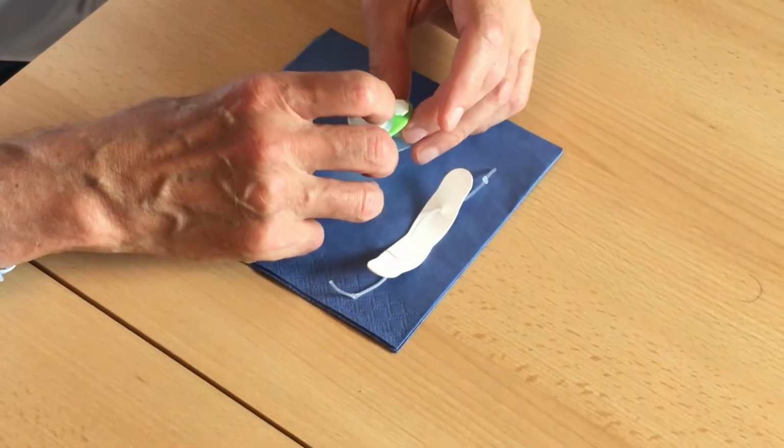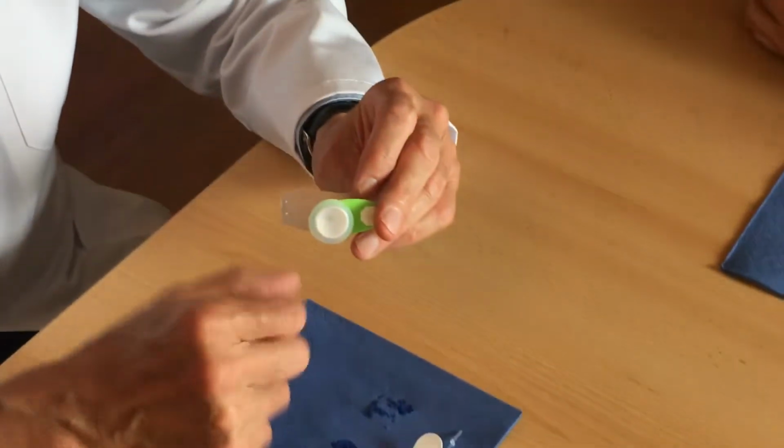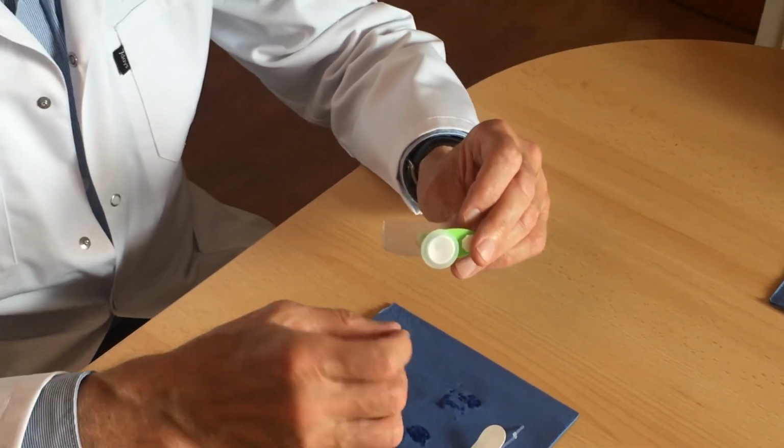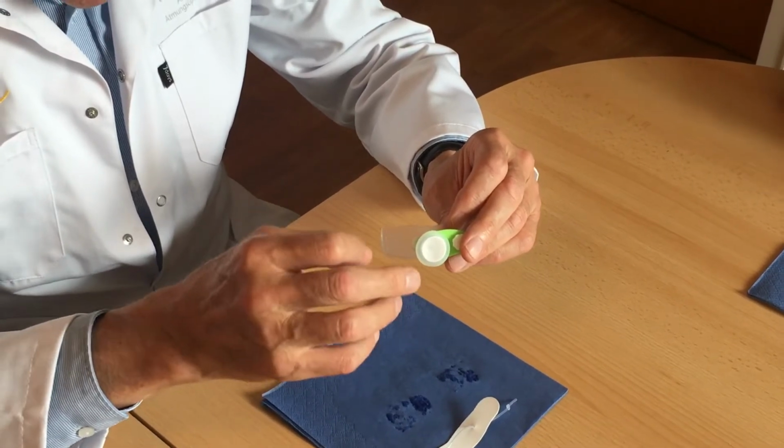As you can see, the activator shows an inversion of the membrane, and this is the indicator which gives the clear signal there is negative pressure. So would you be so kind to do the same exercise?